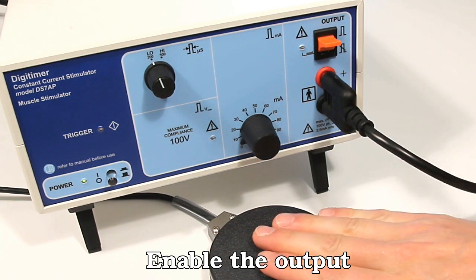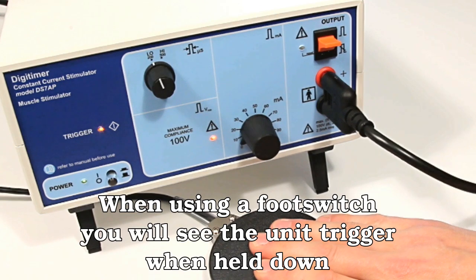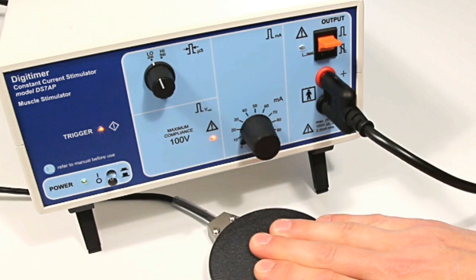With a footswitch connected, stimulation will occur only when the orange toggle switch is in the up position and the footswitch is pressed. Delivery of stimulation will occur at a frequency of 50Hz and is verified by the trigger LED lighting up. Stimulation ceases when the footswitch is released.